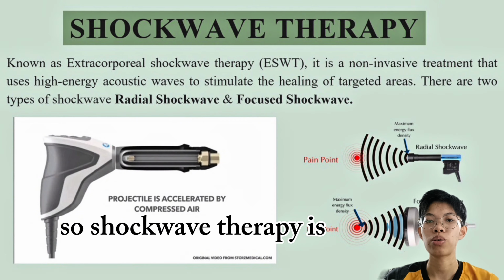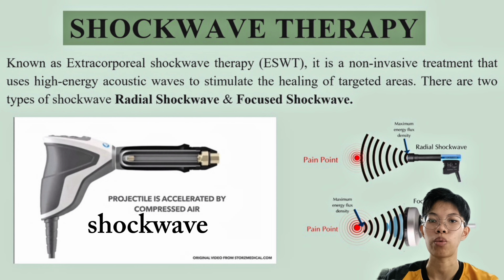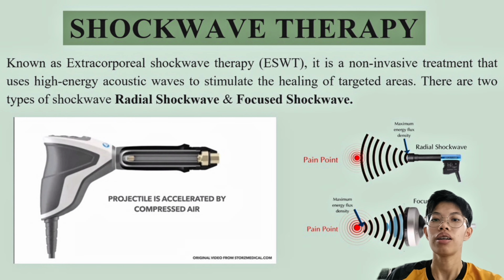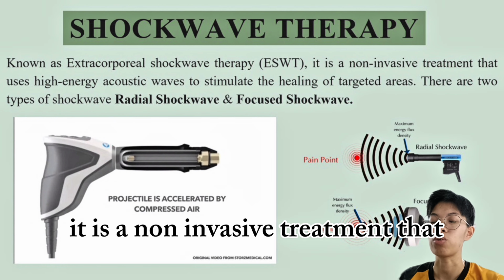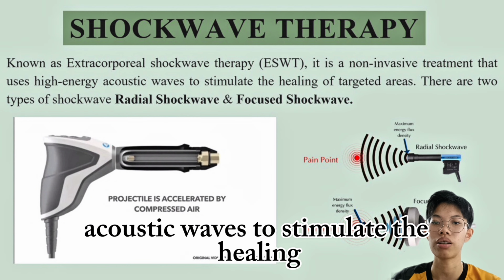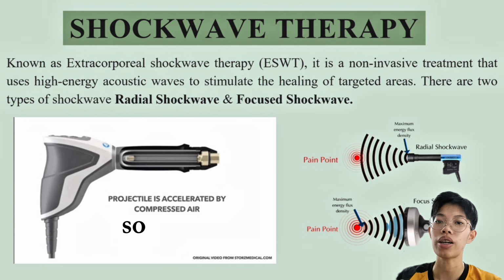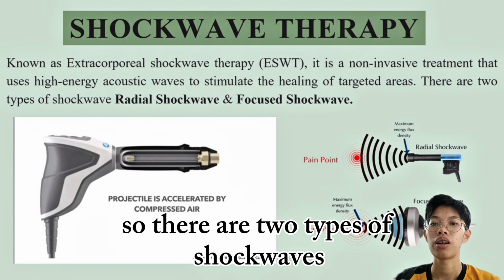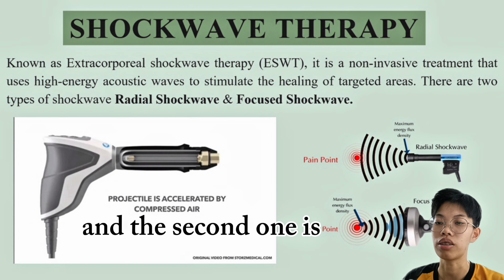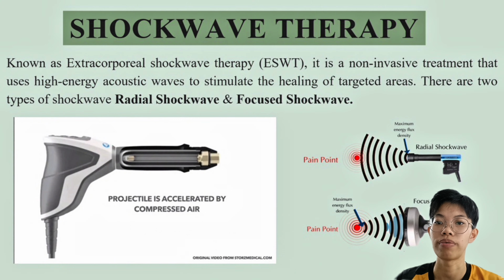So shockwave therapy is also known as extracorporeal shockwave therapy, in short ESWT. It is a non-invasive treatment that uses high-energy acoustic waves to stimulate the healing of targeted areas. There are two types of shock waves: the first one is a radial shock wave and the second one is a focused shock wave.